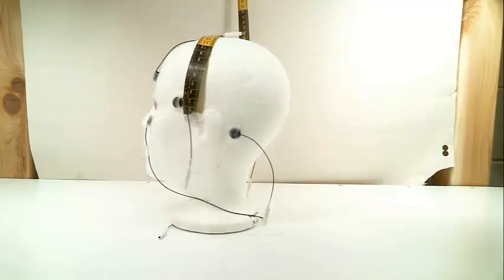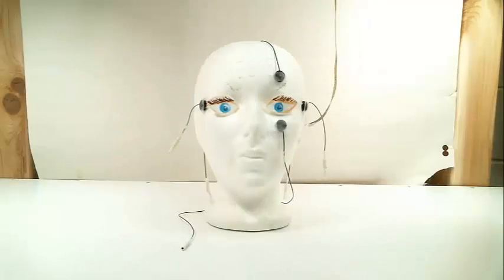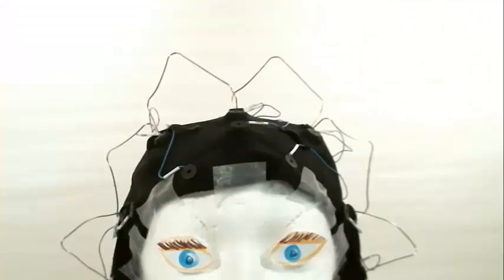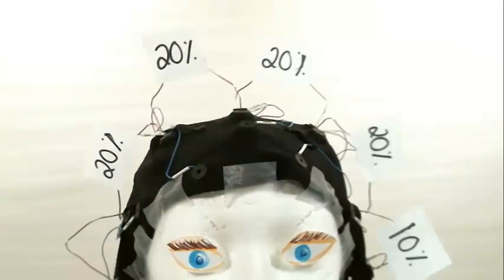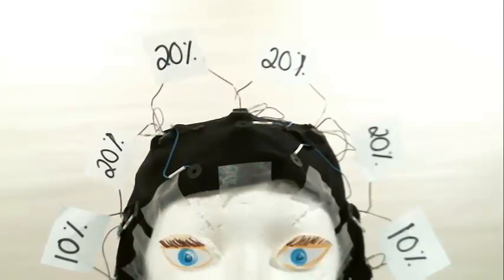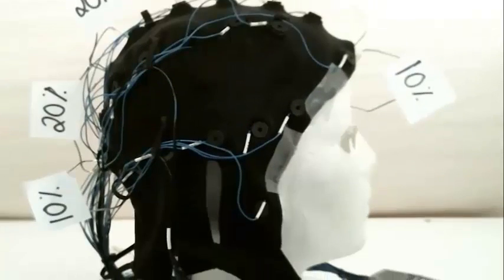Then we measure across the head from preauricular notch to preauricular notch — that is, from ear to ear — and mark that with red as well. The placement of the cap is important because the electrodes are in a fixed position. The international 10-20 system refers to the distances between the electrodes: either 10% or 20% of the inion-to-nasion distance or the preauricular notch distances dictate where the electrodes lie on the scalp.